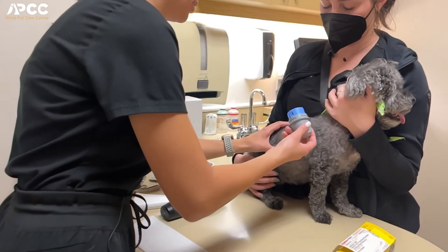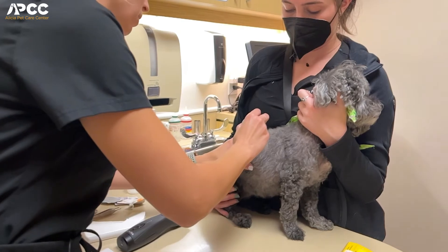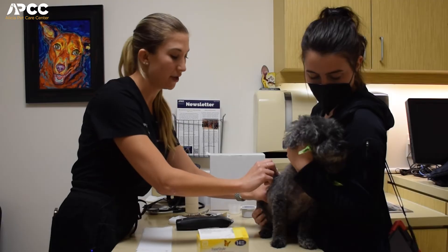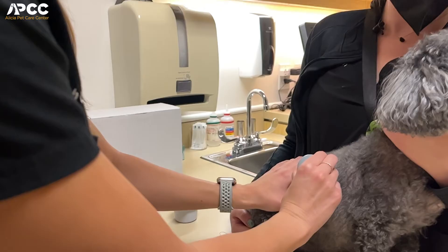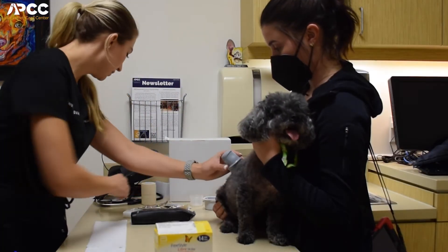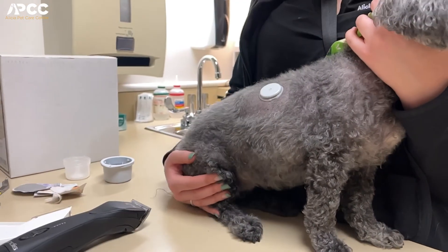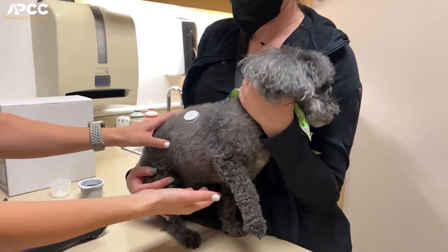Then all we have to do is just press down, and then we just let that stick for about 30 to 45 seconds before removing it. Once it's nice and adhered, we just peel this portion up, and that's the sensor that remains.